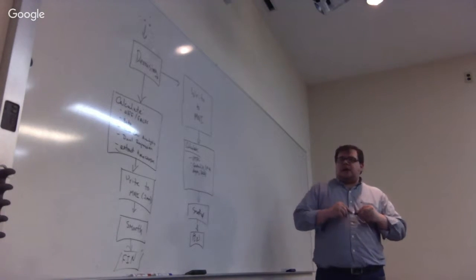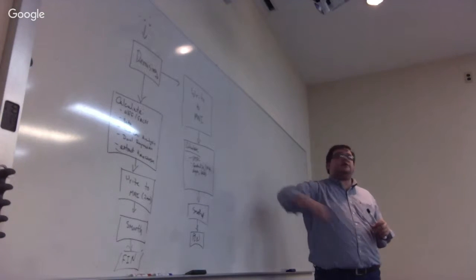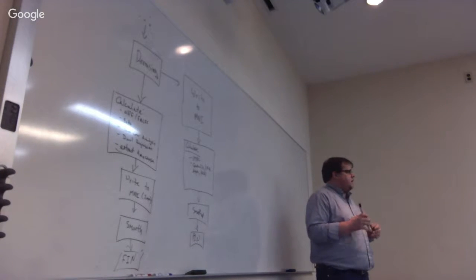So what I can do now is go through a little bit of these derivatives and tell you about them more. But first, are there any questions about this procedure, about why, about how, about anything? Yes? What are your thoughts on the differences? Are there really any differences between smoothing before you do anything to the data or after the fact? Like FSL and SPM do the complete opposite. Do you have any thoughts on that?